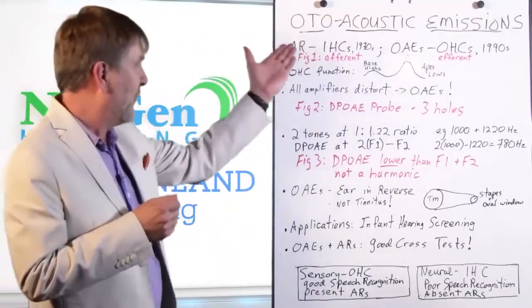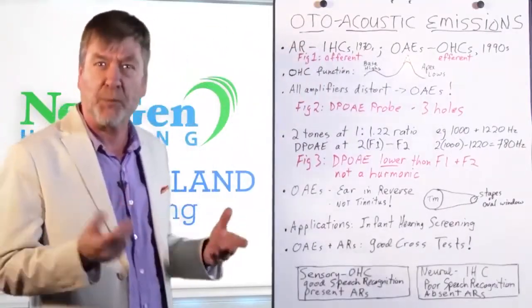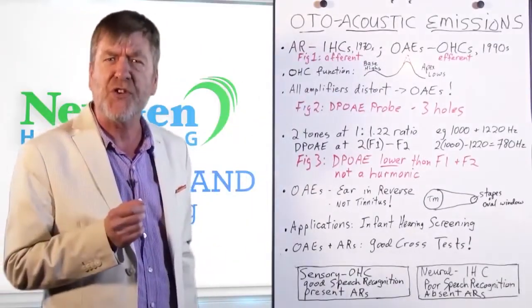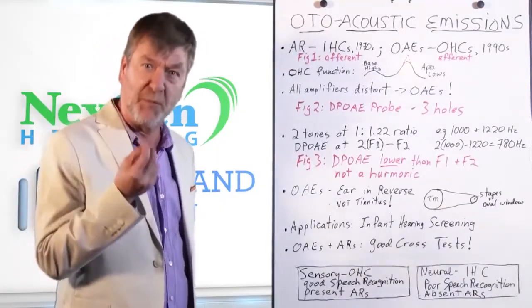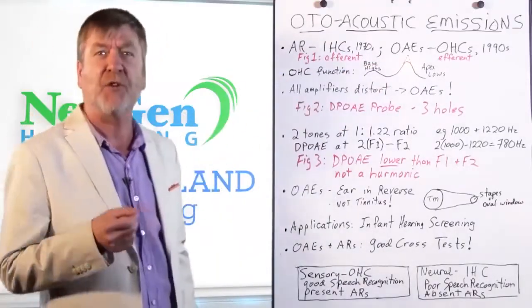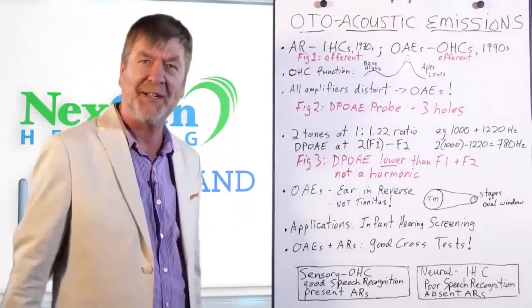At any rate, the acoustic reflex and tympanometry became popular in clinical practice in the 1970s. Otoacoustic emissions, on the other hand, occurred about 20 years later, or the clinical testing thereof became popular in the 90s. So the 90s is actually quite an exciting decade in the hearing health field, and here's why.